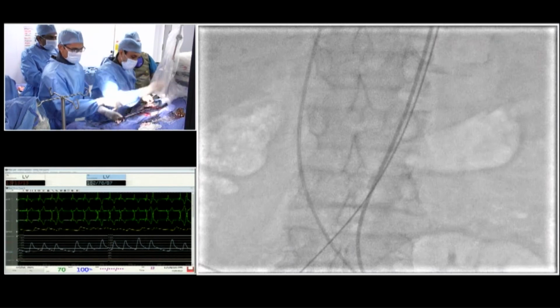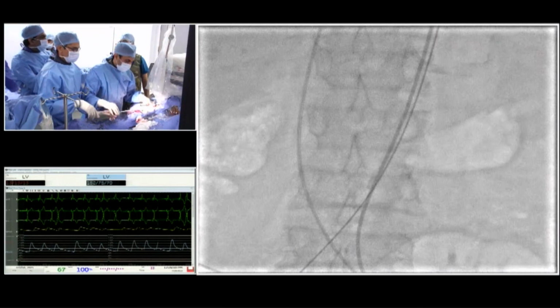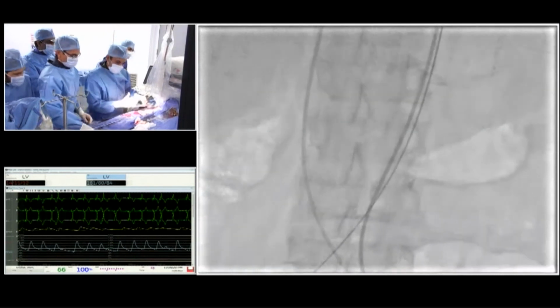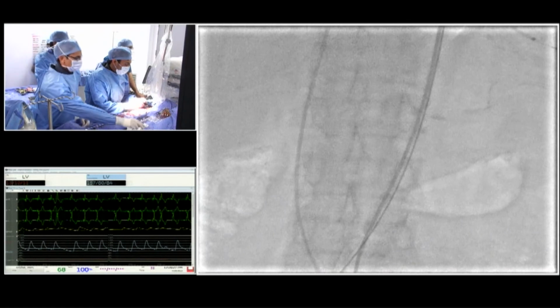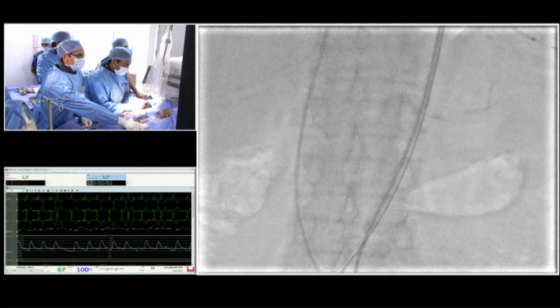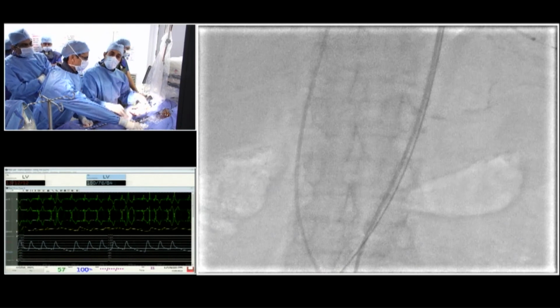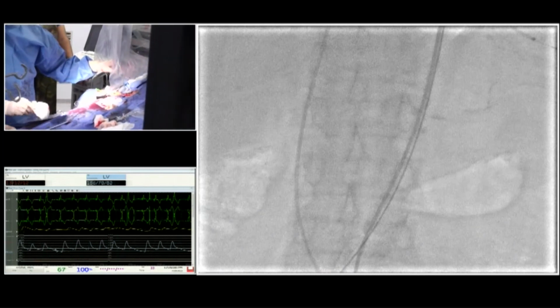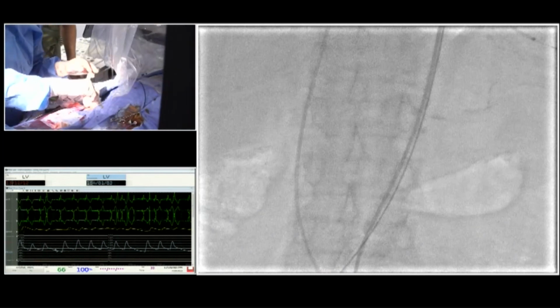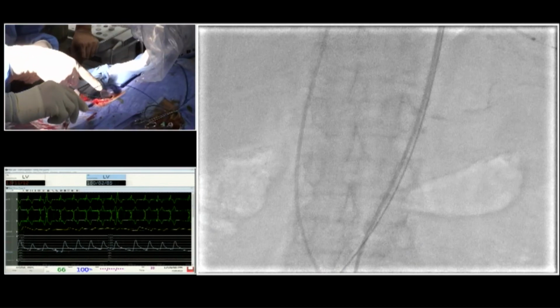Thank you so much. This is one more thing which we want to discuss there on the platform. Now that we are doing only just one AngioSeal, one ProGlide, maybe we can have opinion from experts, Dr. Kodali, Dr. Saurabh Gupta. So we're doing just one ProGlide, and then can you focus here on the groin, please? So just one ProGlide from 3 to 9 o'clock position. And then if there's a pulsatile flow, can you focus on the groin?